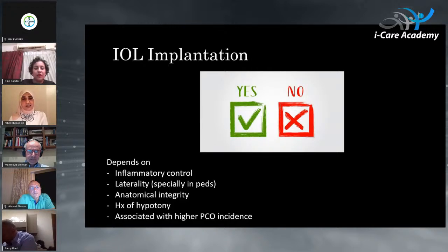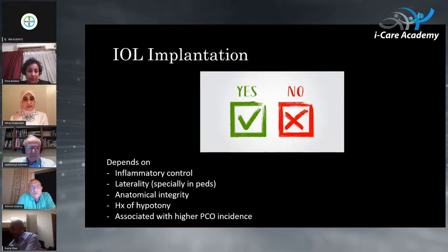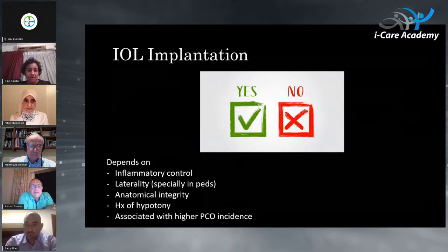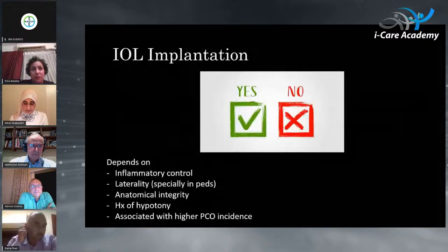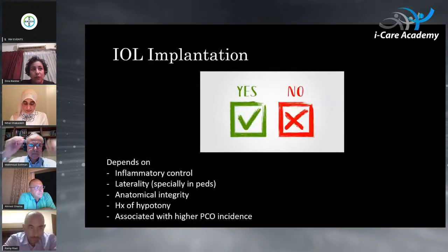Okay, all right. So my question to Dr. Shama: to implant or not to implant in an adult? Now, I presented a poster in 2001, comparing hydrophobic and hydrophilic IOLs in uveitic patients. And I found very good results with both. Nowadays, I implant in most of my patients, but like Dr. Nihal said, patients like JIA, I don't implant. I leave them aphakic.